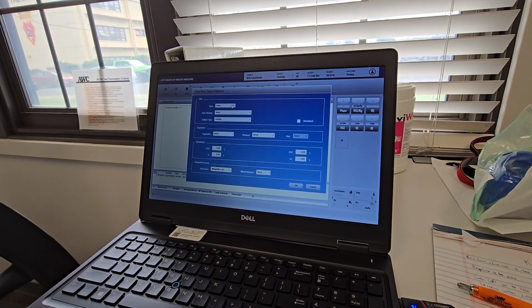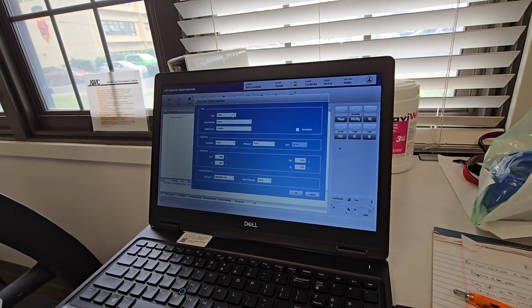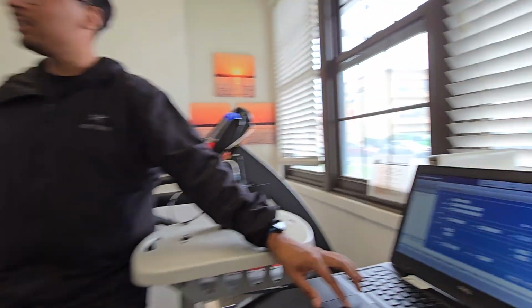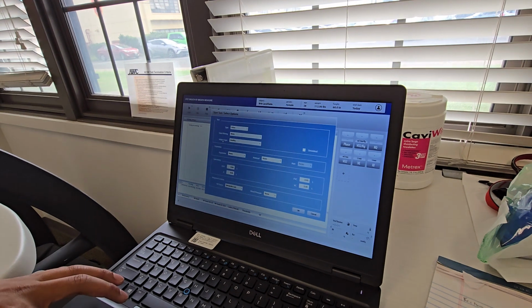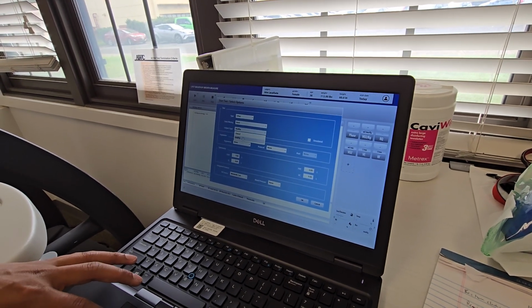All it does is change your predicteds, or actually your predicted information on the tabular results. You'll see it in a little bit. Data filtering, I just wait till the end. You can select your subject type. Once again, this will change your predicteds.